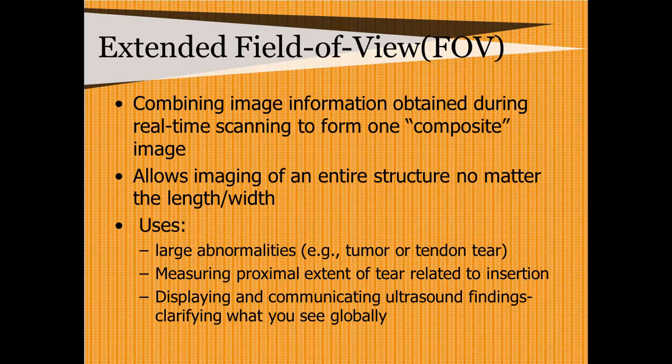So it's good for things like large abnormalities, tumors, or tendons, for measuring big, long things, let's say the proximal extent of a tear in relation to an insertion, or for communicating ultrasound findings and clarifying what you see in a global sense to the radiologist.